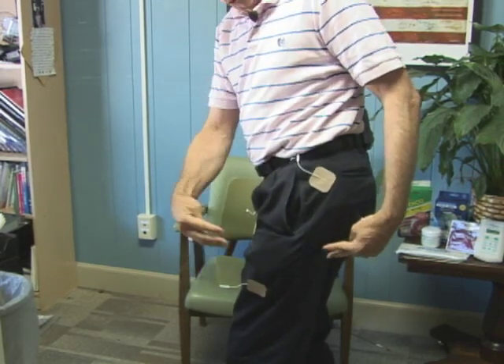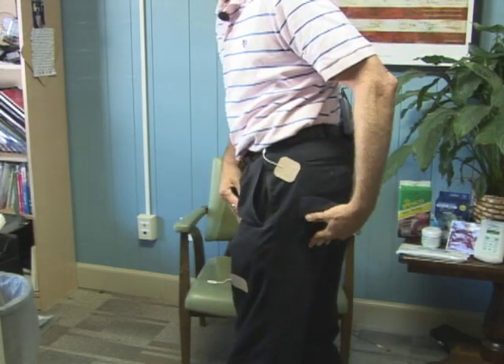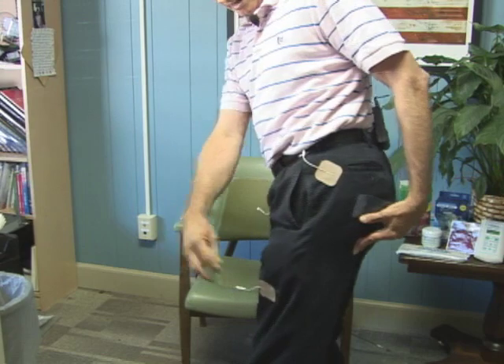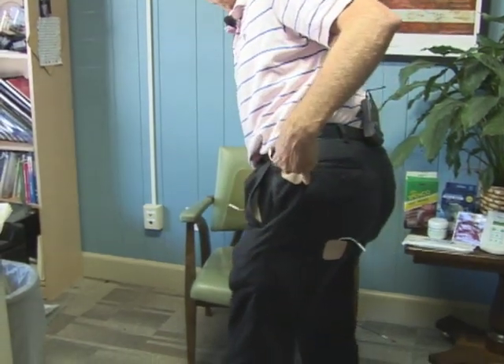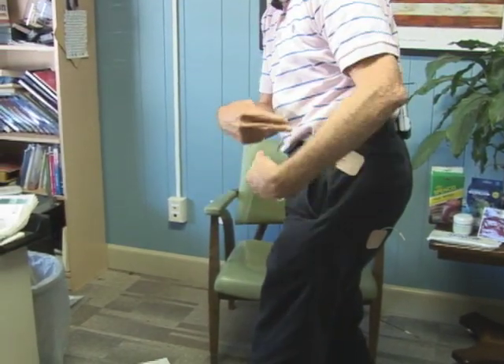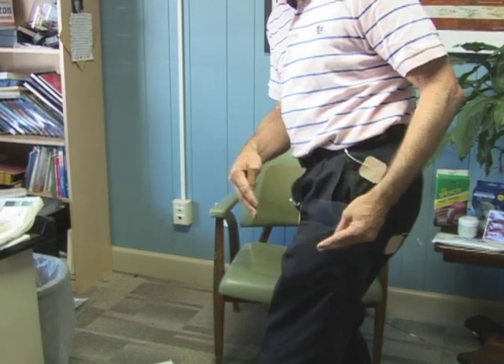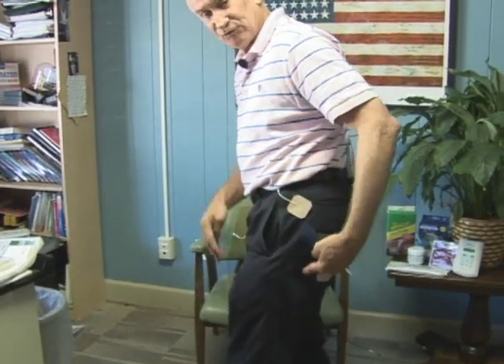Why did we do that? Electricity goes back and forth — you have a sensation going through the hip — what you're feeling is we're deadening the pain in your hip because of that. Now one thing you could also consider: where this is on the outside edge, take it off and put it on the inside of your leg. Now you're dissecting through that area. Electricity takes the path of least resistance — it looks for water, anything with moisture, because that's very conductive. We take advantage of your own anatomy to accomplish our task. That would be an example of electrode placement for hip pain.